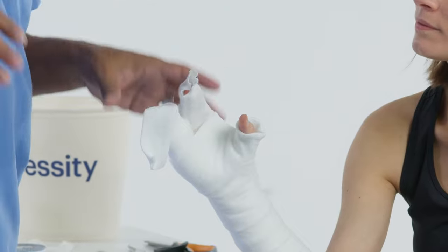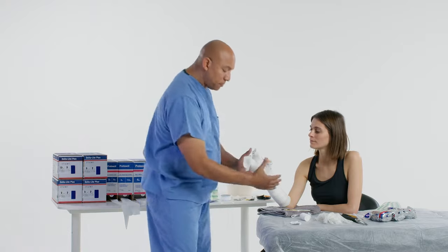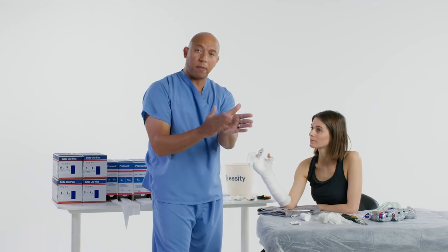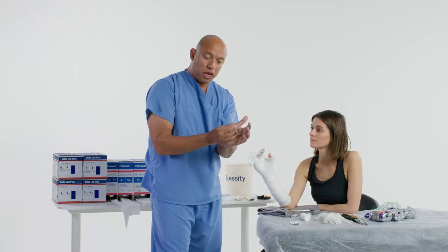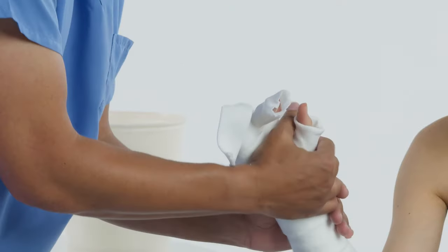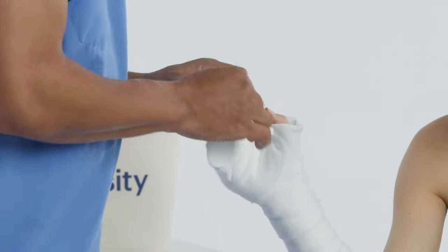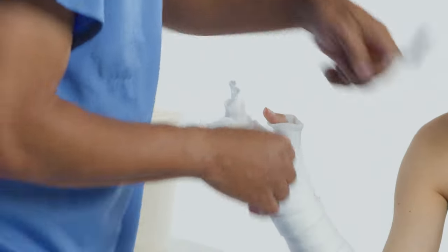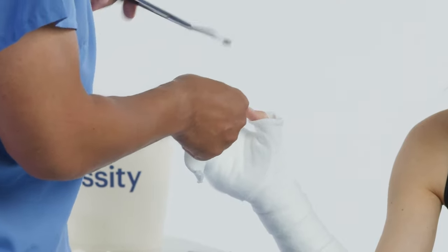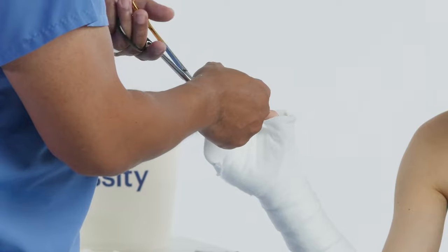This is a good stopping point to understand how I'm going to get the patient in position. Once I have the cast tape on, I'll grab the hand like I'm arm wrestling the patient, put one portion of my hand on the back side of the wrist, and use that meaty portion in the area where the wrist will be extended — that keeps wrinkles from forming. I'll get the patient back and then push the fingers down.